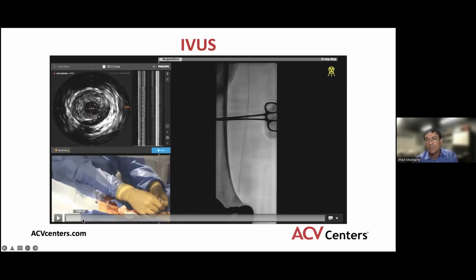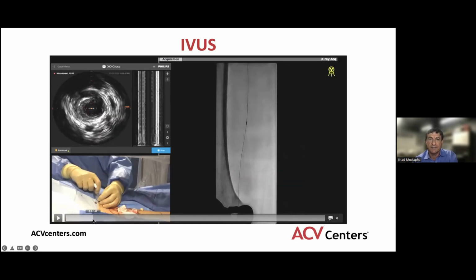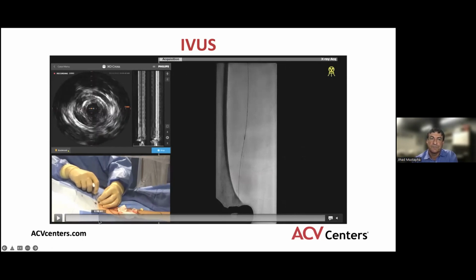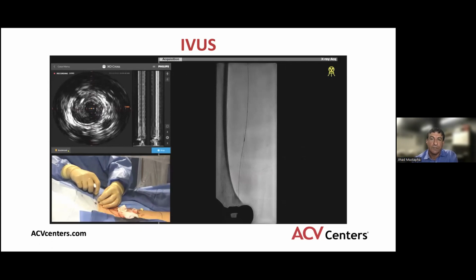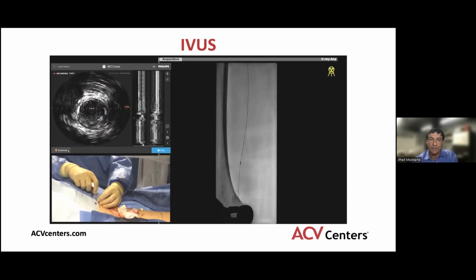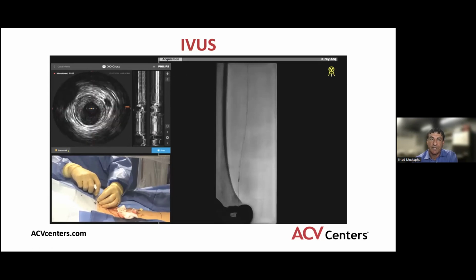And we use this method where we mark the beginning of something like this. This is basically what we call a very high plaque burden disease. This is very concerning in terms of embolization, obstructive flow, dissections, flow limiting dissection, and complete obstruction of the flow in the artery. Notice the speckles of calcium deposit in the fibrotic tissue, as well as the organized thrombus within this diseased area. This is probably a plaque that ruptured at one point and became organized.